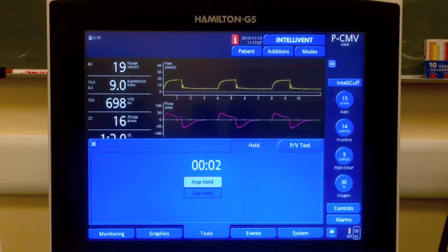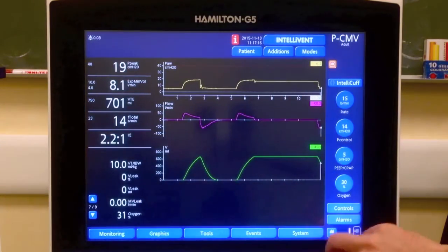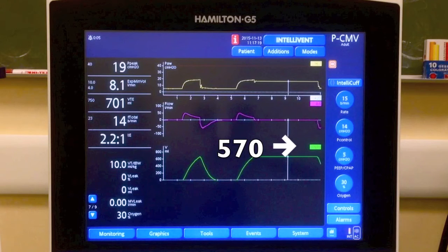First, going on Tools, we perform an inspiratory hold for a few seconds to measure the plateau pressure. In this case, the plateau pressure is 16.7 cm of water and the tidal volume is 570 ml.